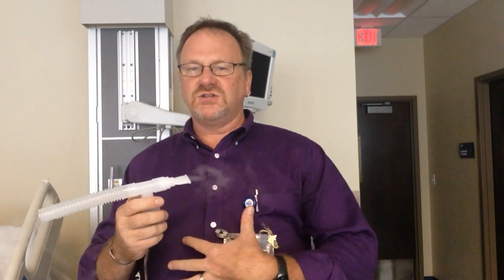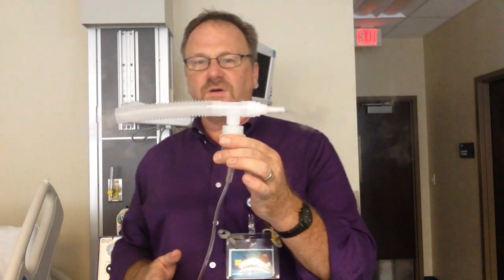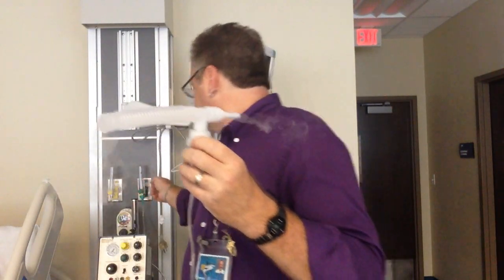That way they're getting the medication deep in their lungs, they're breathing on it. If patients tend to breathe very, very deep on it, they will typically hyperventilate. So that is the small volume nebulizer, the Acorn Neb.